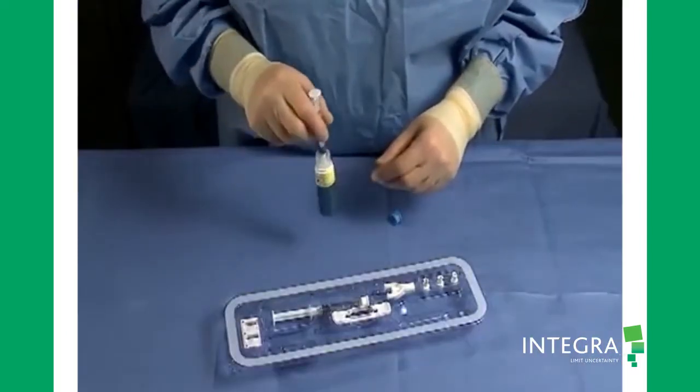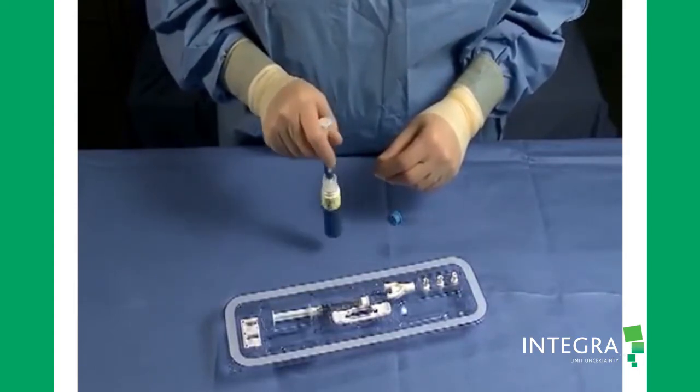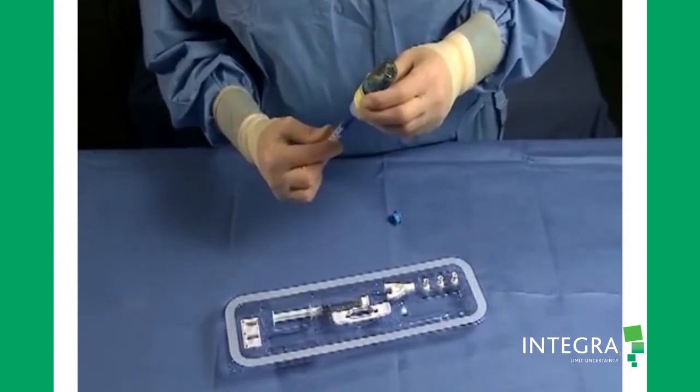Swirl the vial until the powder has dissolved into the solution. Draw the solution back into the syringe and remove.